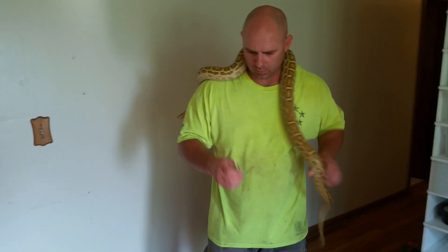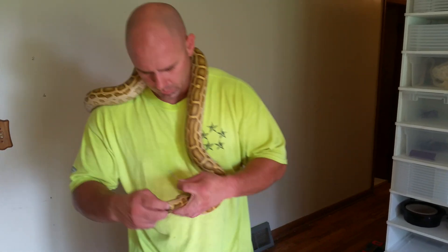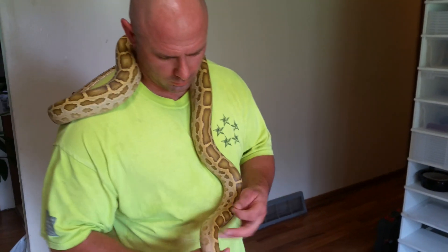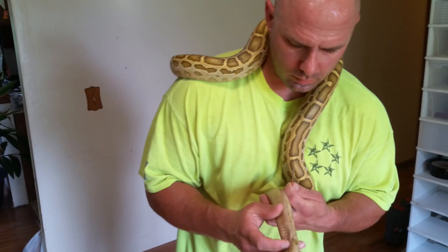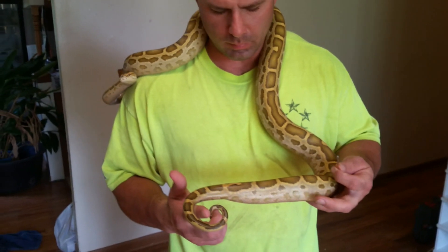I've got a Burmese python out here and I'm going to do a quick video on how to probe a snake. Snake sex organs are inverted — they're inside the body — so just looking at the snake you can't tell whether it's a male or female.